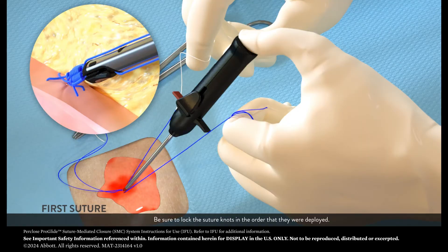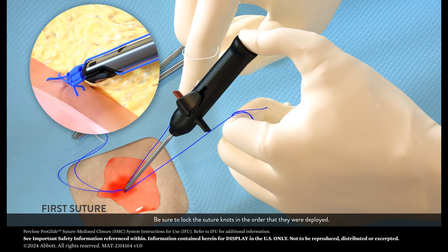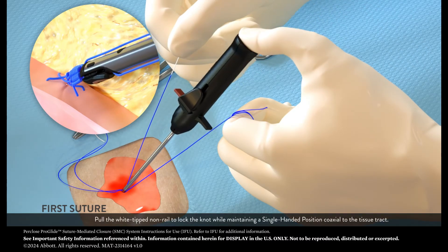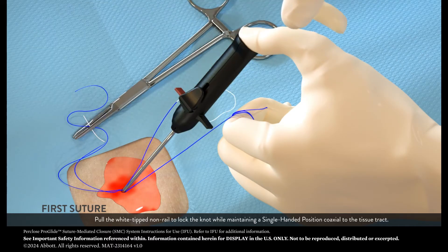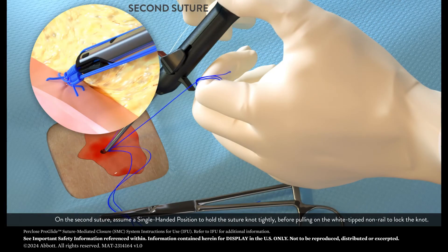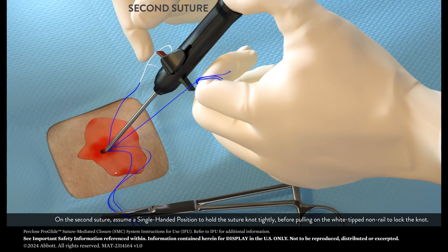Be sure to lock the suture knots in the order that they were deployed. Pull the white-tipped non-rail to lock the knot while maintaining a single-handed position, coaxial to the tissue tract. On the second suture, assume a single-handed position to hold the suture knot tightly before pulling on the white-tipped non-rail to lock the knot.